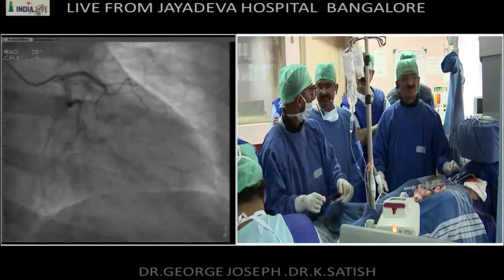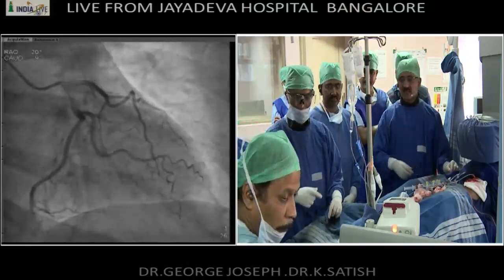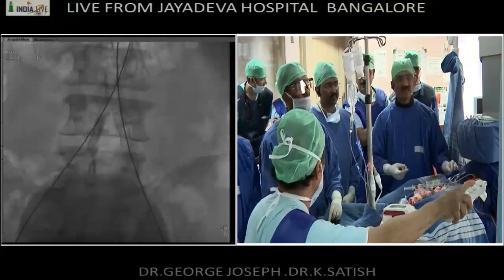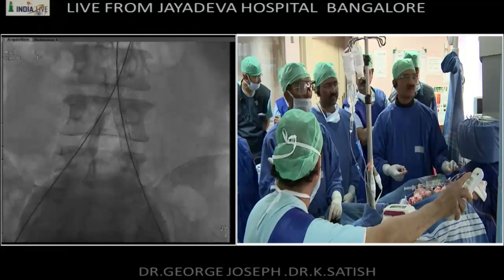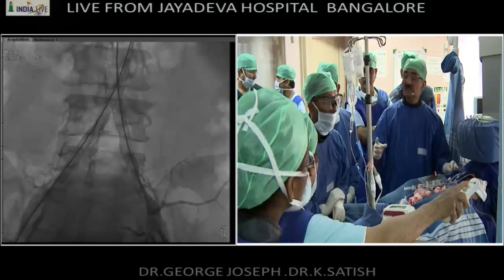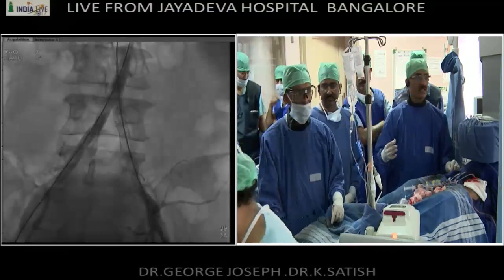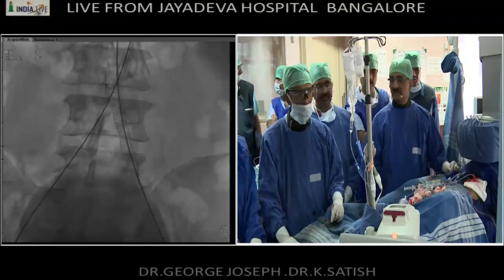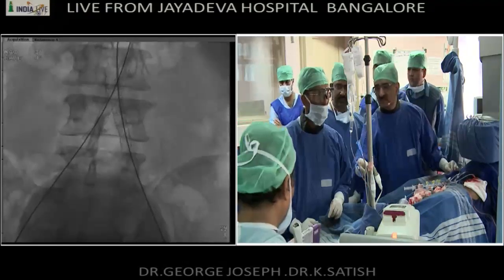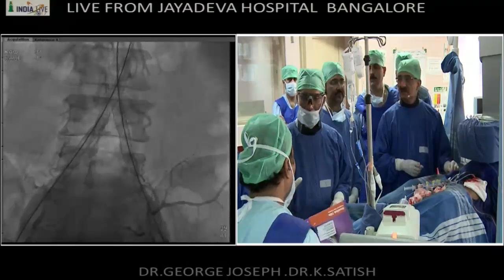Or maybe a short balloon expandable, just keeping at the bifurcation. Why not? That will also work. Oh, just hold on. Shall we put a short balloon expandable? Now we have a problem with getting the right self-expanding stent. Okay, 7 by 39. No, longer.